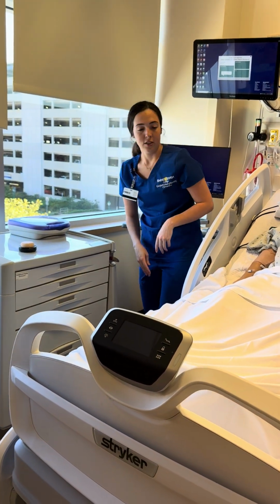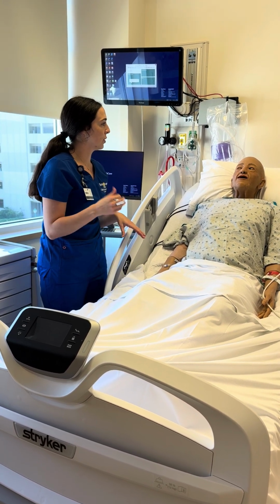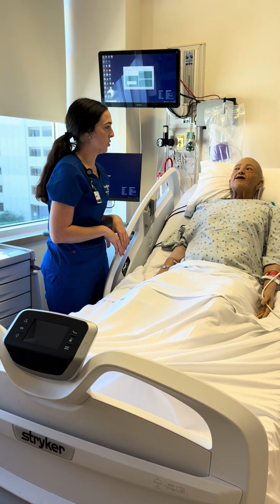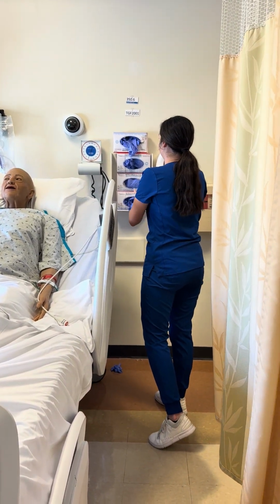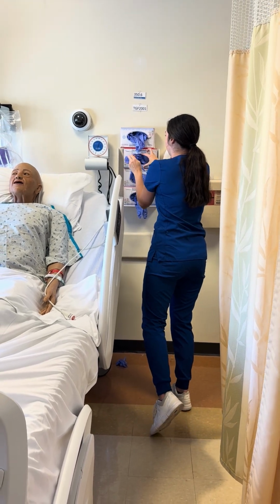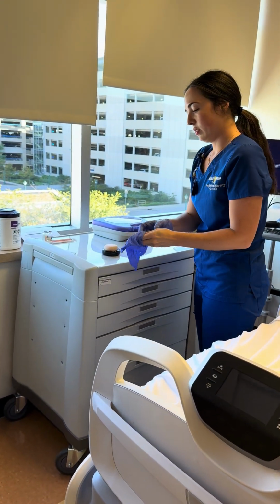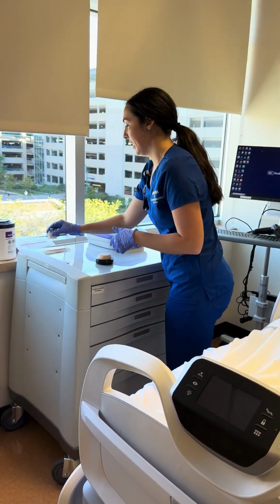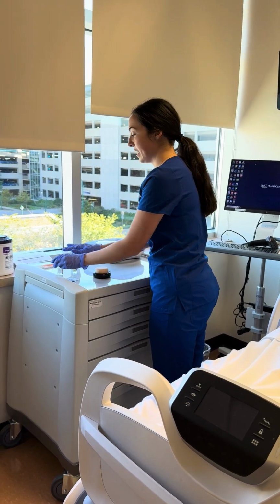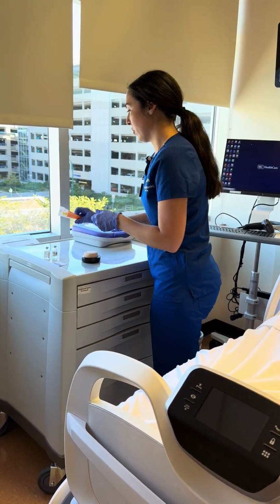Okay. So your blood glucose was a little bit high, so we're going to go ahead and notify our house supervisor, and we're going to go ahead and get ready to inject your insulin. So I'm just going to do hand hygiene again. I'm going to grab my gloves. We're going to mix up our insulin over here. So I'm doing my second check while preparing the medication. So I've got my NPH, which I need 17 units of, and I have my regular insulin, which I only need 7 units of.